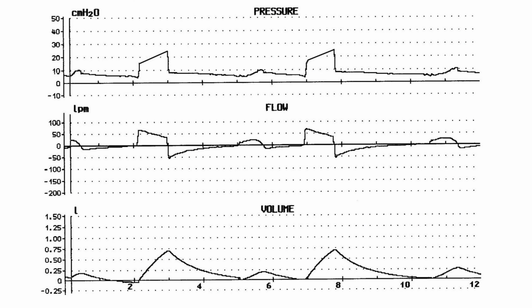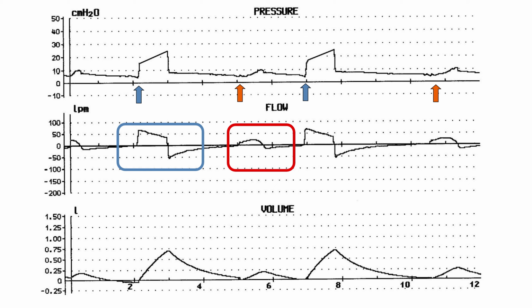And this is what SIMV looks like without pressure support. This is a decades-old printout for a patient on SIMV volume control with unsupported spontaneous breaths. Note that the patient is getting 2 types of breath. The first one is a volume-assisted breath. I can say it's a volume-assisted because of that little divot before the pressure waveform. The second is a spontaneous breath here, and that is characterized by the sinusoidal patterns that you're familiar with.